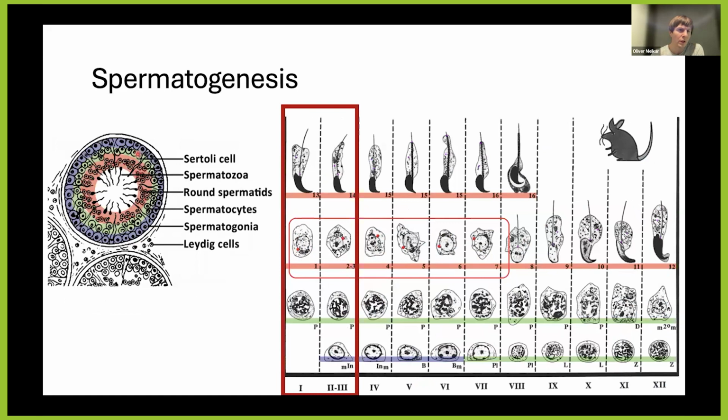So as I said, if you look at this tubule again, you could draw three circles inside. The earliest, the slowly dividing cells, are the spermatogonia, and then they start to divide and undergo meiosis, and then haploid cells eventually are these red ones, and they develop into spermatozoa.